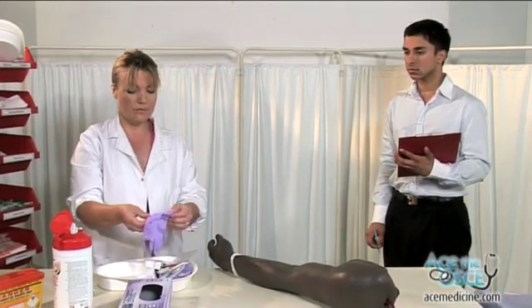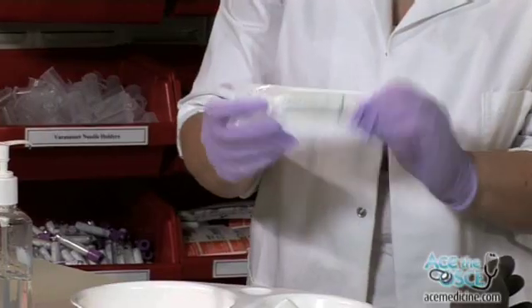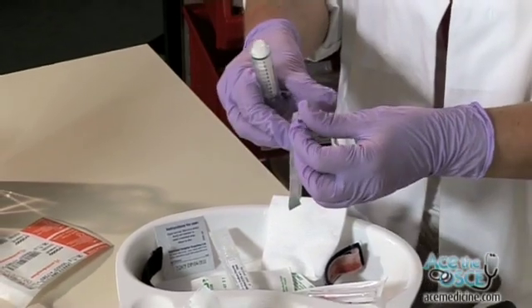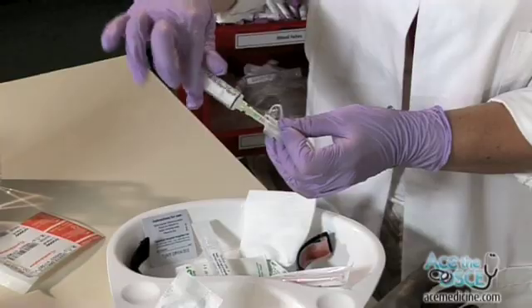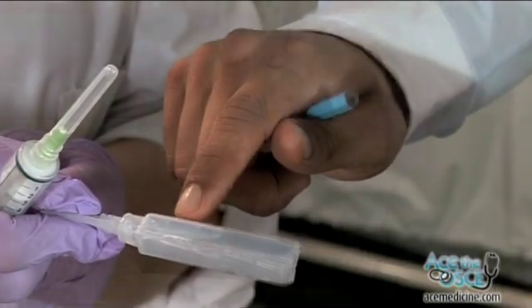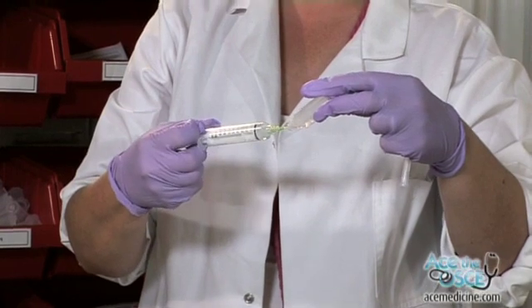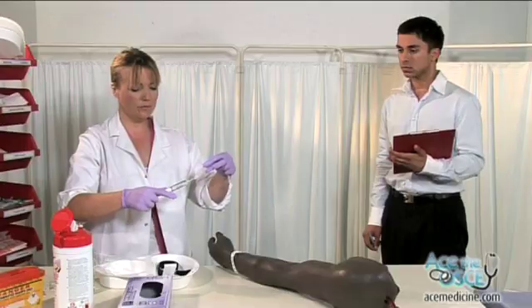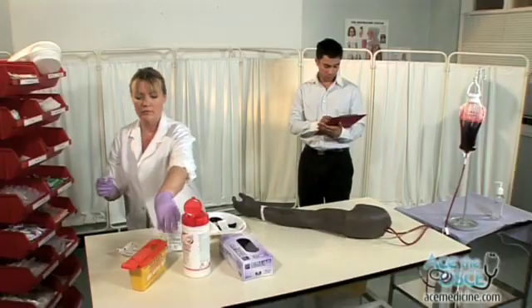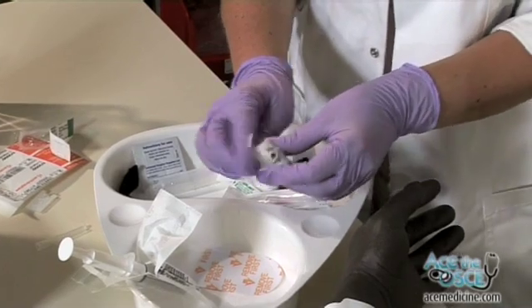Put on gloves. Prepare the equipment for the flush. Confirm the name of the flush solution and the expiry date with an appropriate member of staff. Draw up at least 5ml of solution into your syringe. Remove any excess air from the syringe. Carefully dispose of the needle into the sharps box. Replace the syringe into the packet. Prepare the sterile cap and cannula.